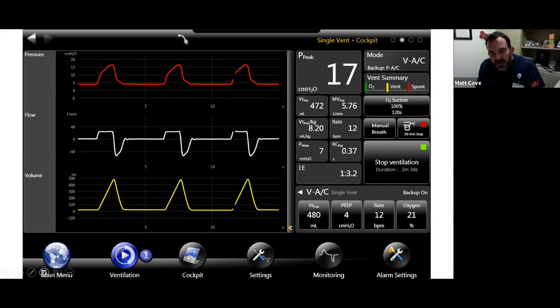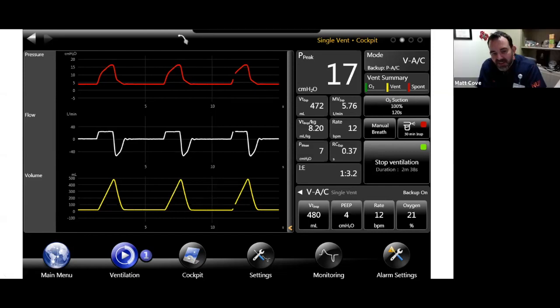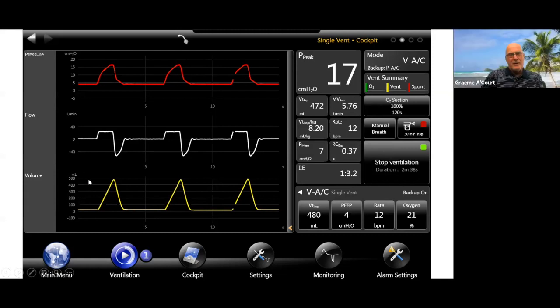We don't normally see that value on the ventilator. Yeah. And so basically what we don't see, we don't worry about, I guess. And you don't know, right? Yeah. Obviously everyone checks the expiratory flow waveform. Yeah, make sure you're coming back close to zero before the next breath. But we don't actually have that number.